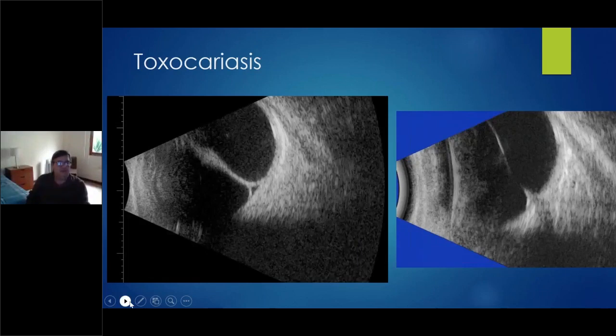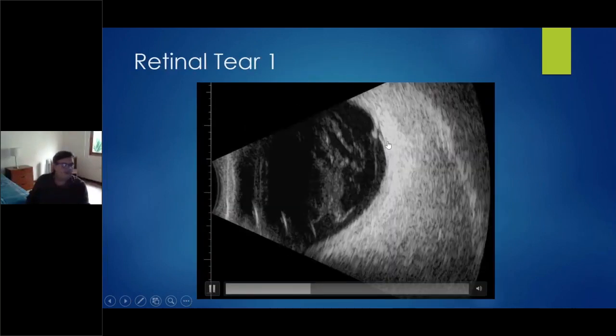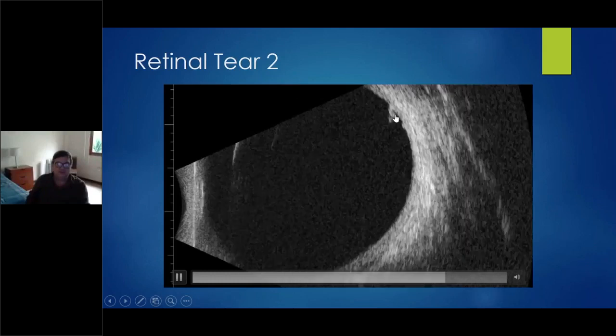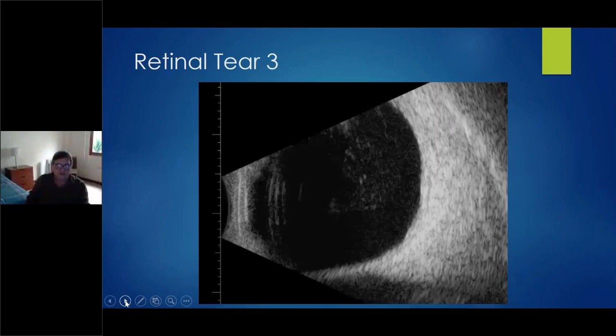For retinal pathology, with a retinal tear, it is very important to locate the exact position of the tear in order to make the laser treatment or the surgery. And you can also say in which position it is and what happens with the anterior part. Look, again, this is a longitudinal in order to get this peripheral vision, if the retina is elevated at the borders of the tear. Okay, retinal tear bigger. You can see, also for retinal tears, the longitudinal approach is very nice.